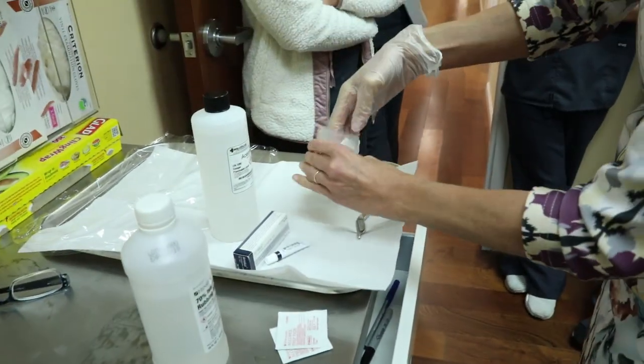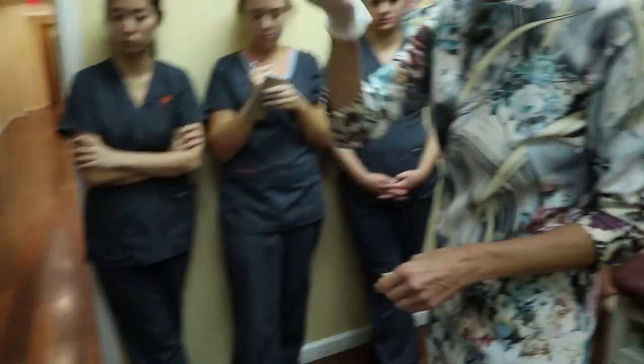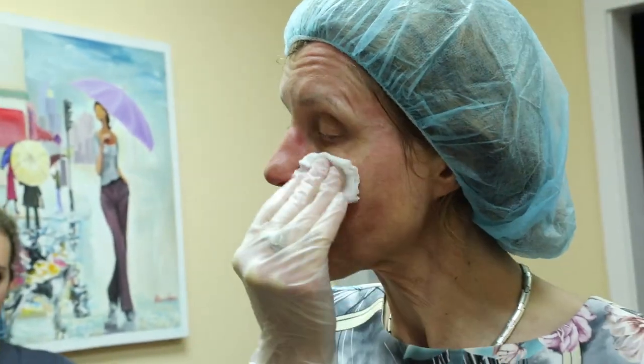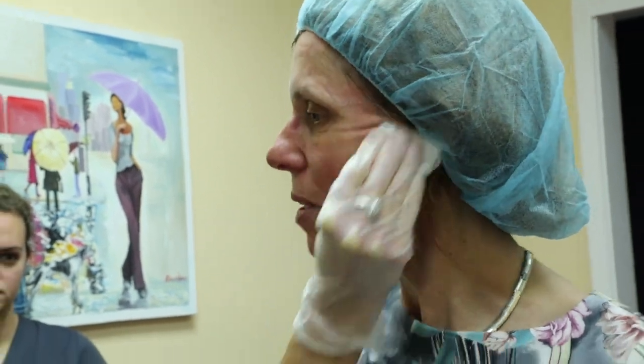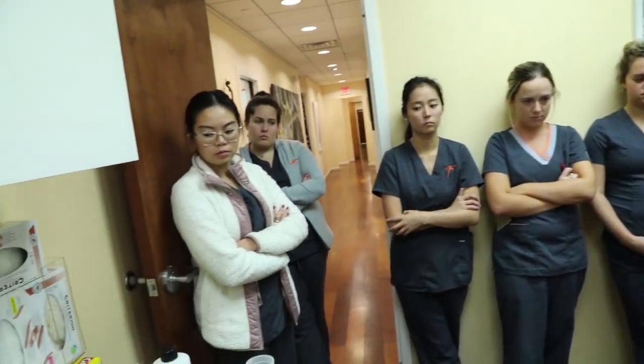With your acetone and the gloved hand, but in a very quick motion, you're going to be applying acetone everywhere so that the skin degreases. Be careful not to go onto the lashes or in the eye — the patient has their eyes closed during this process. It smells terrible. Then you turn the glove around with the inside folded in, and nothing has melted and everything is okay.